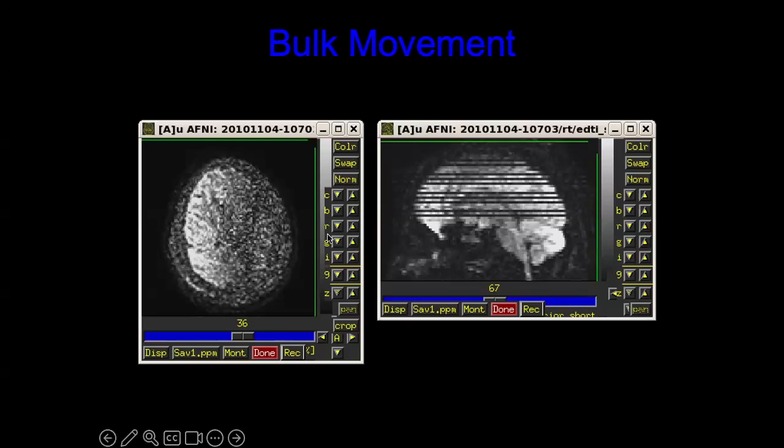So this is an axial slice that is starting to go into being just noise. I took a stack of these axial slices and I'm showing them to you in the sagittal plane, and you can see all these slices that were affected by motion that are now just noise. So if you're going through your data before processing, you need to see are there volumes with different diffusion directions where someone was moving, and then I have to throw this away because obviously your diffusion parameters will not be correct if you're calculating the noise instead of the real change in signal.